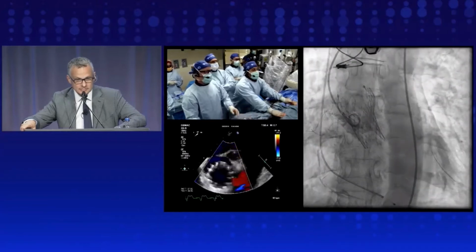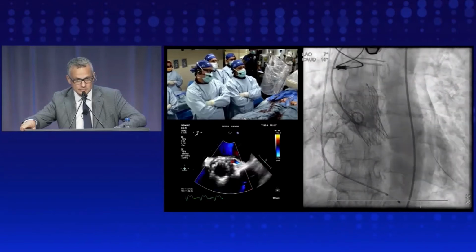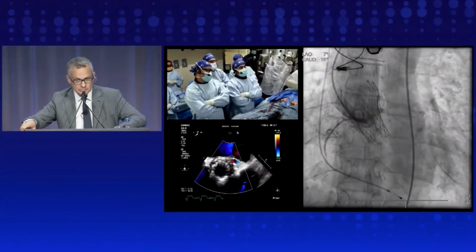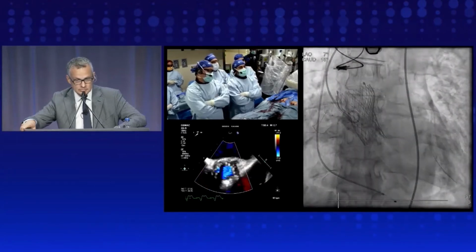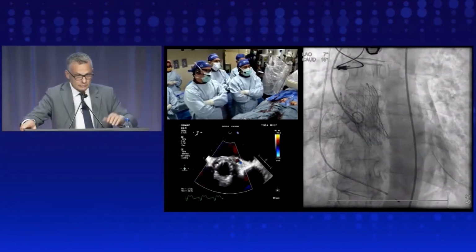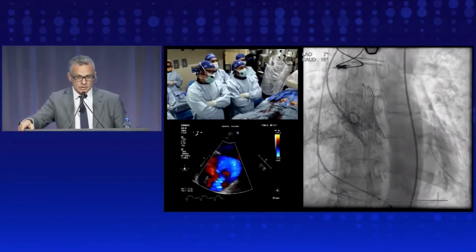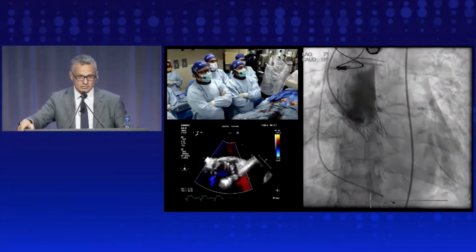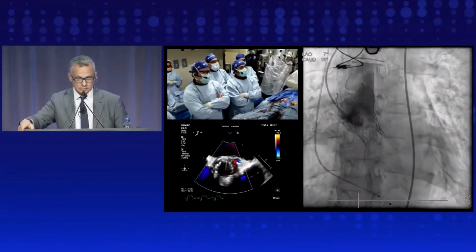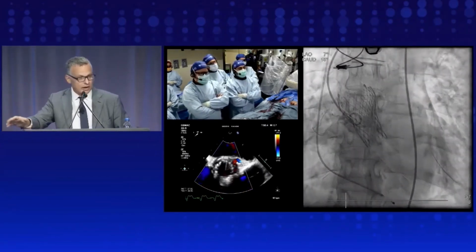Well, Francesco, if I may comment also, I think during the procedure, especially in centers that adopt the technique, it's very important to have good communication about the position of the very tip of the catheter. The attack angle can be seen on fluoro, but where you are in reference to the commissures and the coronary offtake, quite often we find that echo biplane imaging is very important to confirm the position. So you guide Basilica by echo? Yes, we go a lot back and forth between fluoro and echo, just to confirm. So, right. What's going on with the mid-distal right? You think that's spasm? So we're just opening.